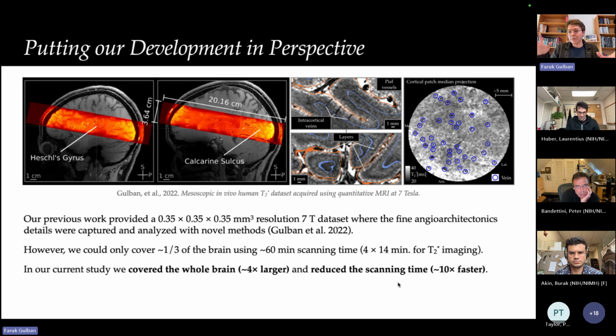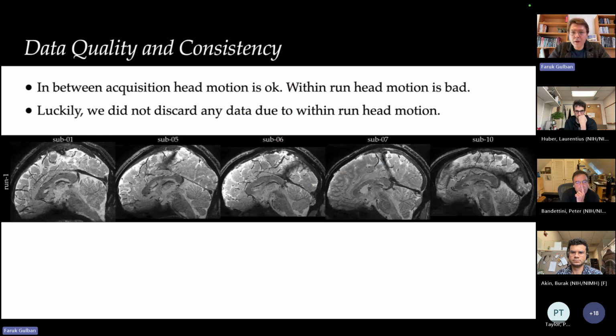This really becomes a very exciting moment in time, because imagine you can go to the scanner, conduct your fMRI experiment or diffusion or whatever. And at the same time, by spending 7 minutes, or maybe just to be on the safe side, scanning your anatomical data twice, you can spend 14 minutes to acquire 0.35 millimeter isotropic resolution living human brain data, right? At this resolution, for the whole brain.